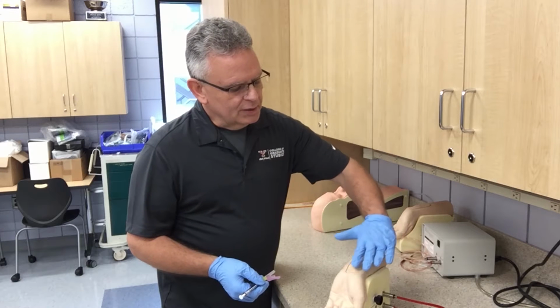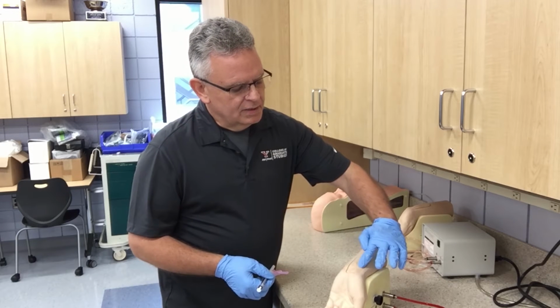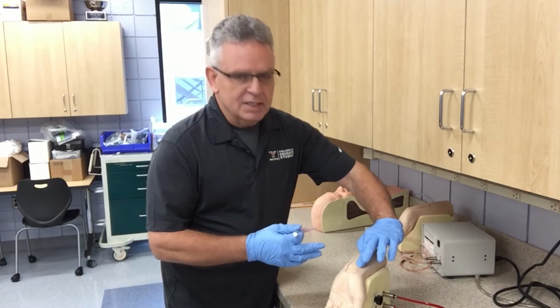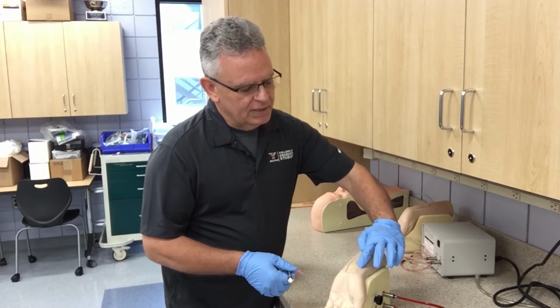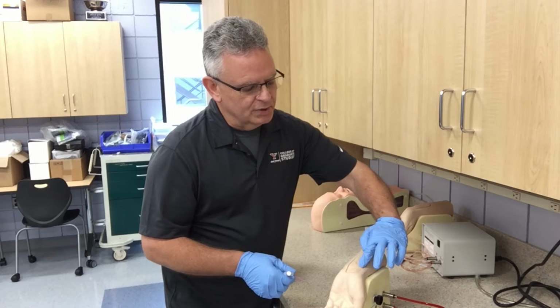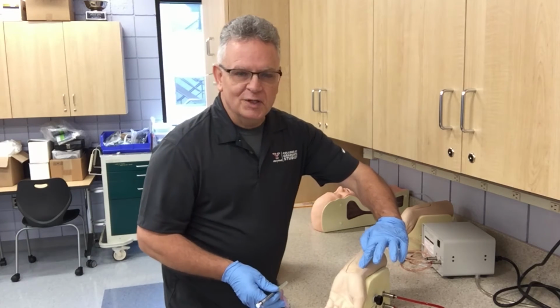So the finger is aligned linearly with the artery running in this direction, the finger being placed here, and then slowly rock the finger back and forth until you can actually feel the curvature of that artery. Feel where the pulse is the highest. That should be the center of the artery. And then once you've located that, line up the center of your fingernail with that point where the pulse is strongest, which should be the place where you're at the center of the artery, and then make your puncture at a 45-degree angle just before your finger. You don't want to stick your finger during the procedure.